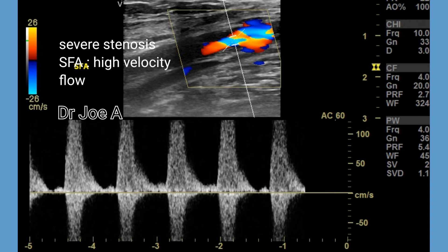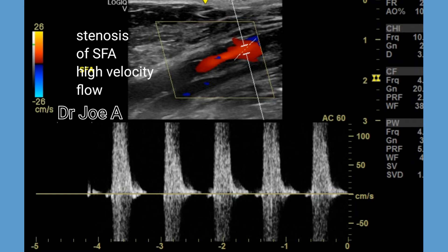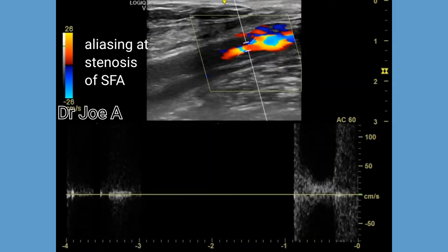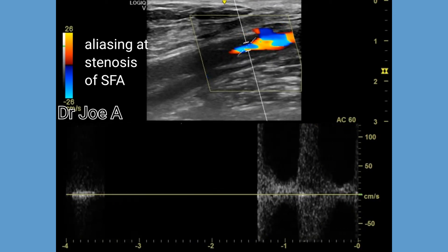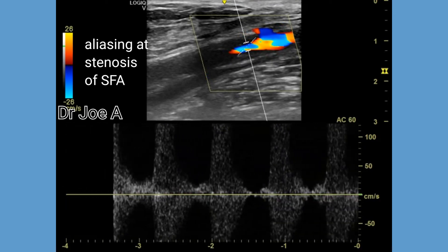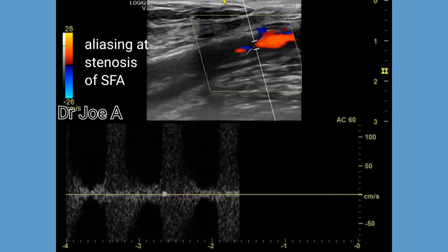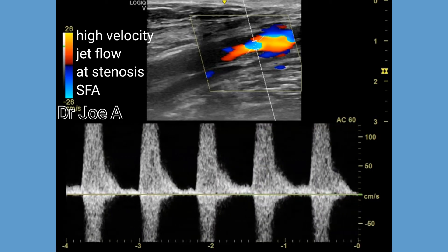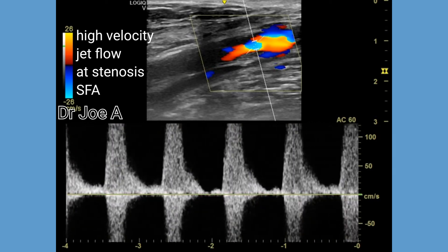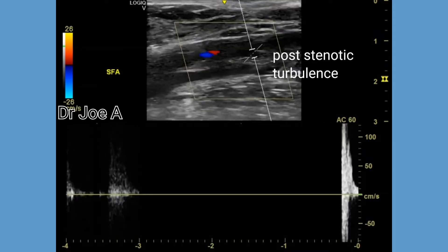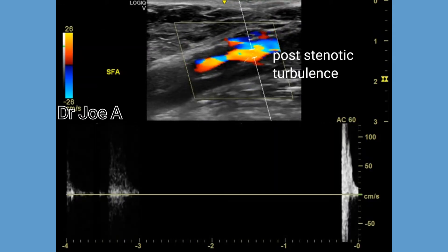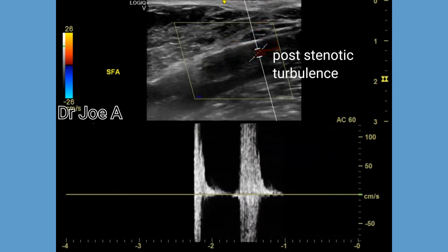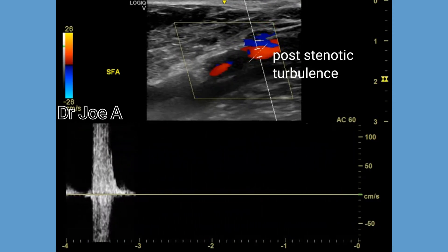On spectral Doppler, there is very high velocity flow at the level of the stenosis. In the post-stenotic segment of the SFA, there is markedly turbulent high velocity flow.